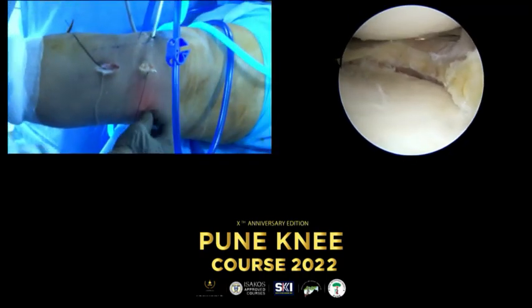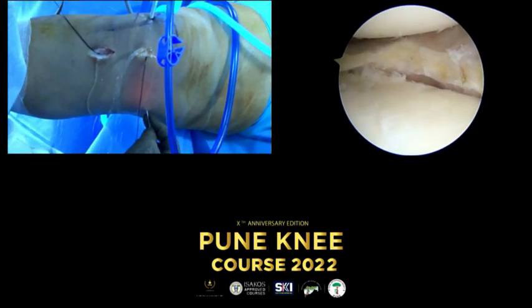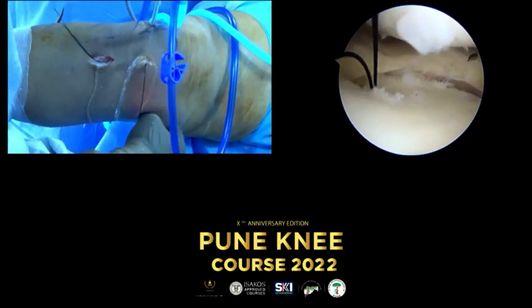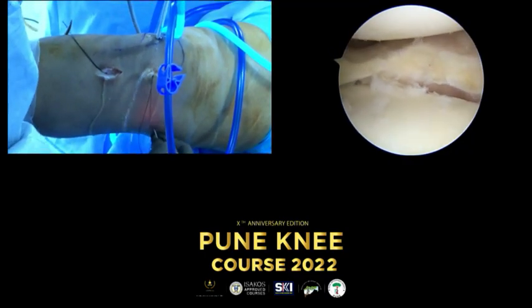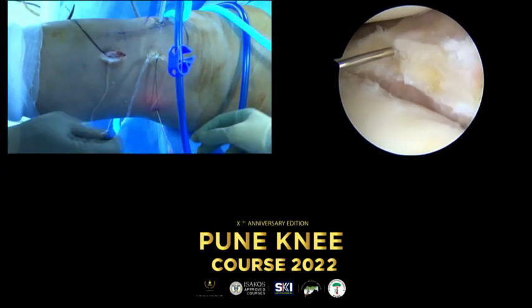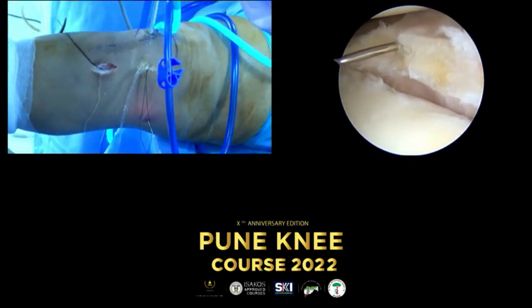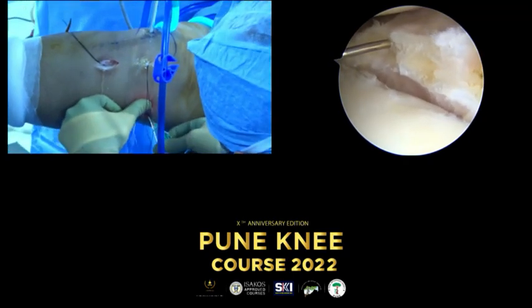This is too anterior. This is too high. Still too anterior. I like it better. One up. I need you to make a stab incision with a number 11, and the other spinal needle.